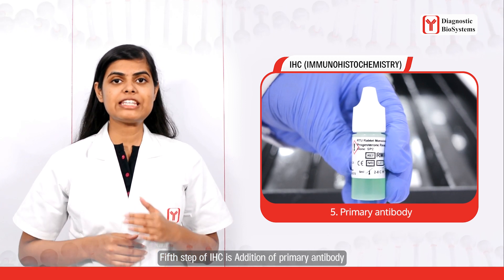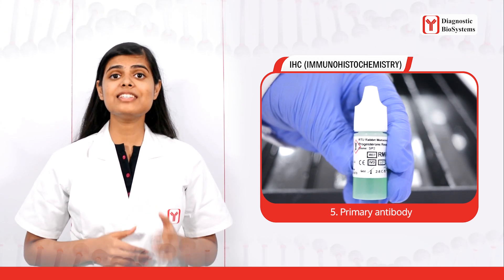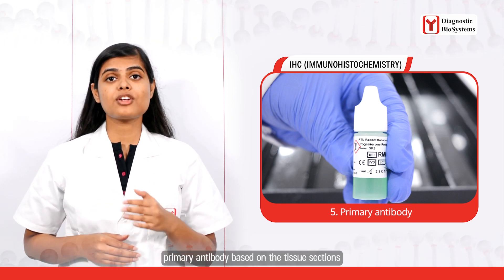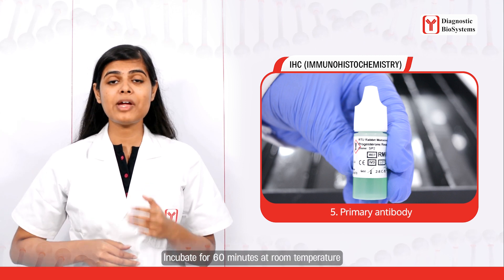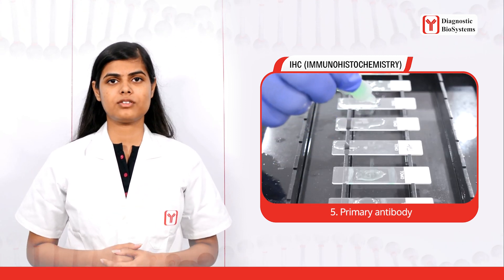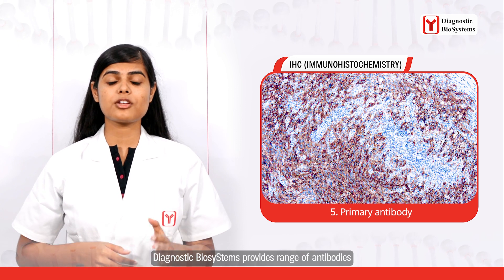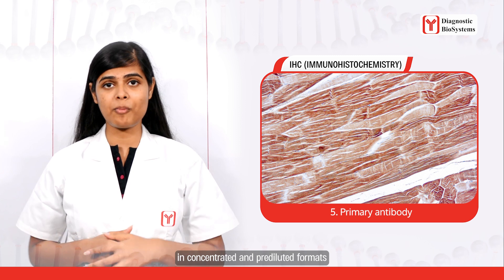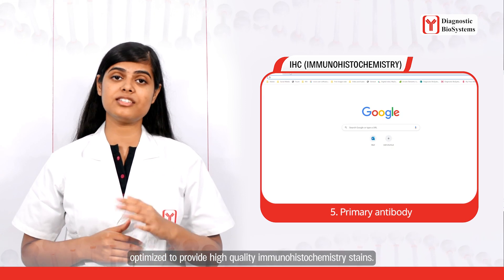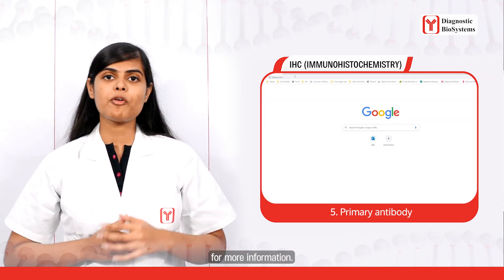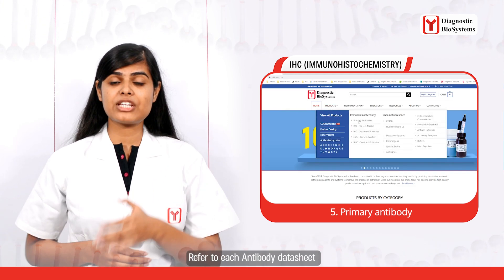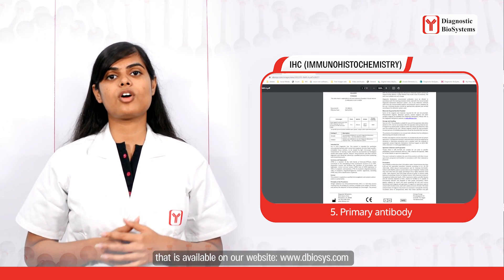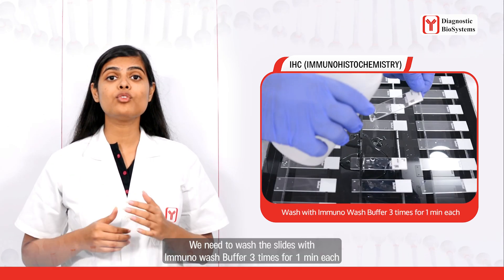The fifth step is addition of primary antibody. Add 100 to 150 microliters of primary antibody to the tissue sections and incubate for 60 minutes at room temperature. Diagnostic Biosystems offers a wide range of antibodies in concentrated as well as pre-diluted formats, optimized for high quality IHC stains. For more information, refer to each antibody data sheet available on our website at www.dbiasys.com. Wash the slides with immunowash buffer three times, one minute each.